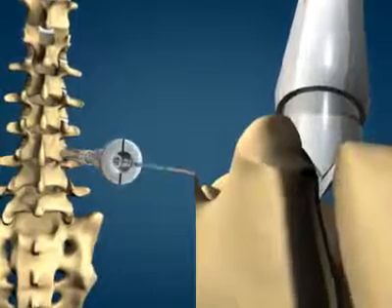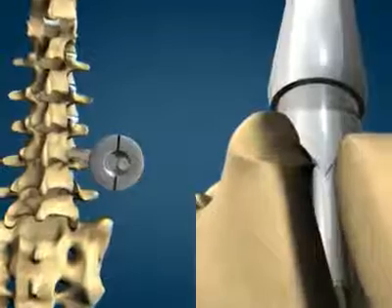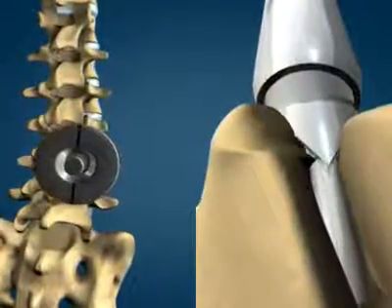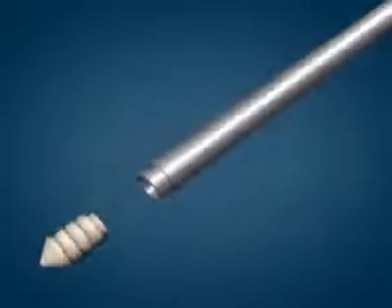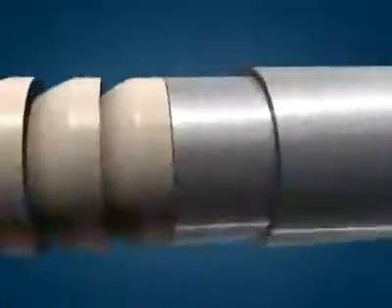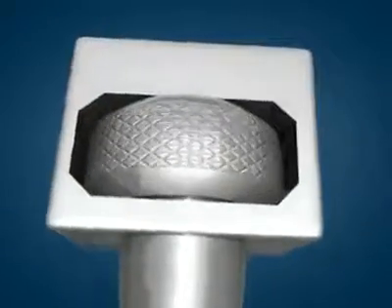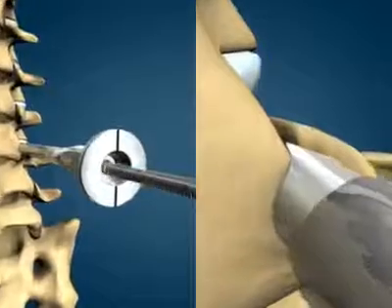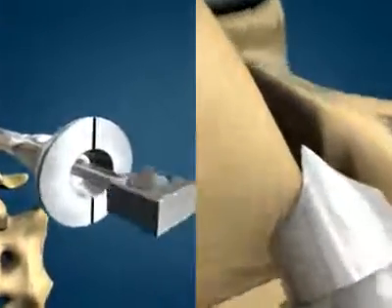Insert the facet sound into the drill guide to ensure an end point and sides to the hole if warranted. Load the NuFix dowel onto the inserter. Advance the NuFix dowel down the drill guide.